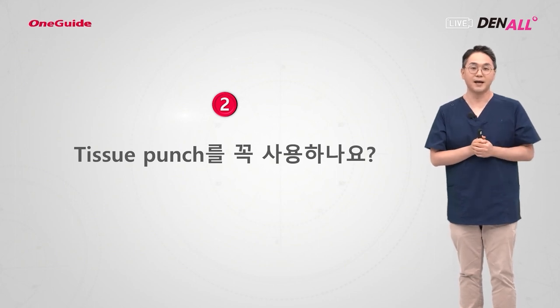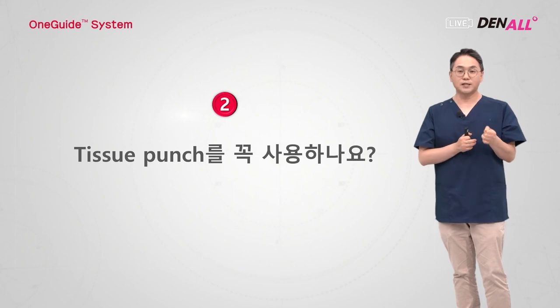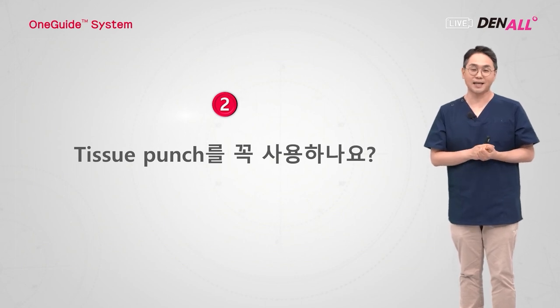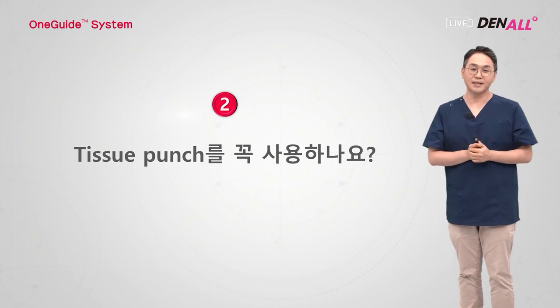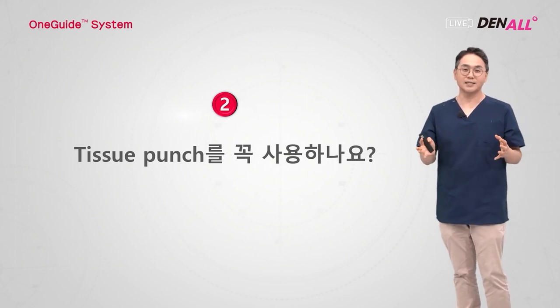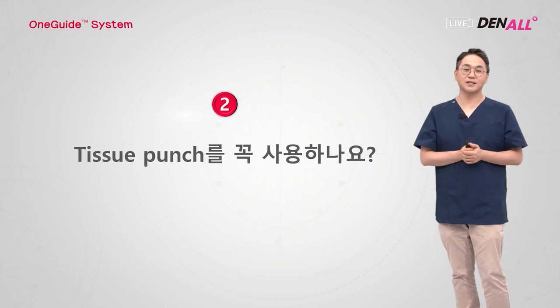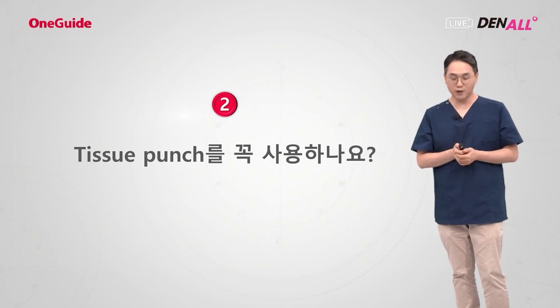According to many papers, even if soft tissue debris goes into the bone drilling site, it does not interfere with the osseointegration. So you can drill directly when gingiva is thin, but use the tissue punch when keratinized tissue and the soft tissue is thick, like in the upper posterior after healing.